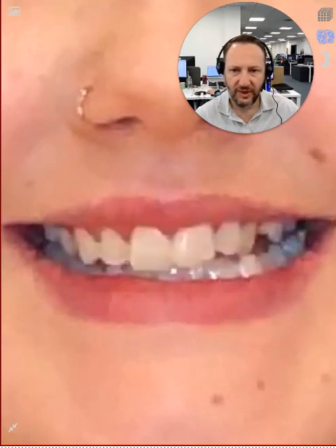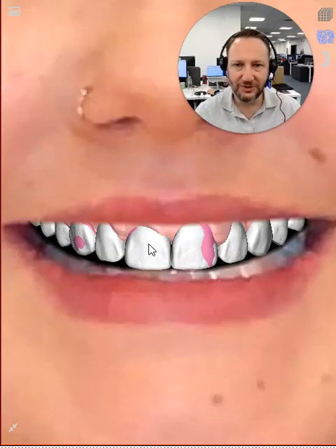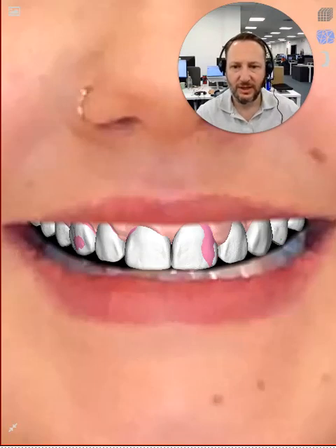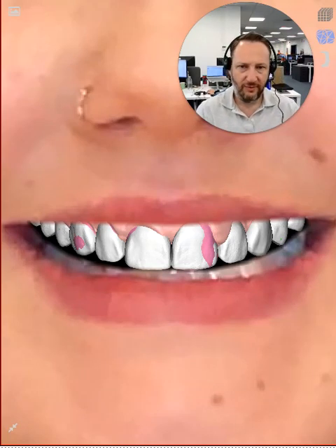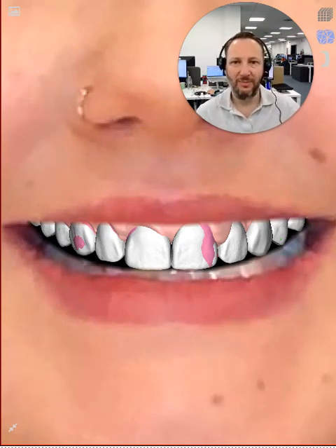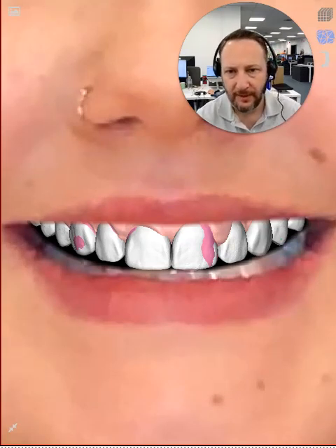The second advantage, since we have a lot of visual content, is to bring the patient to participate in this process. So here we can share, we can do mock-ups, we can share these ideas with a lot of images so the patient can really understand what we want for them. They can visualize in advance our goal and they can make better decisions. So a great advantage, this number two.